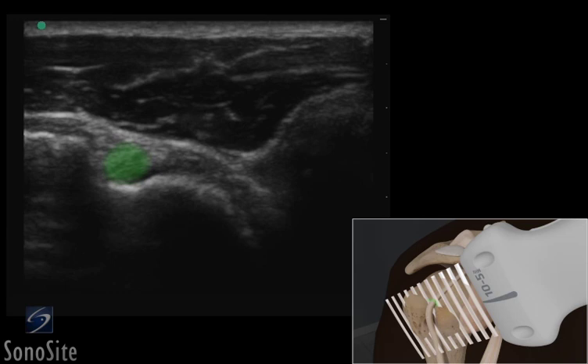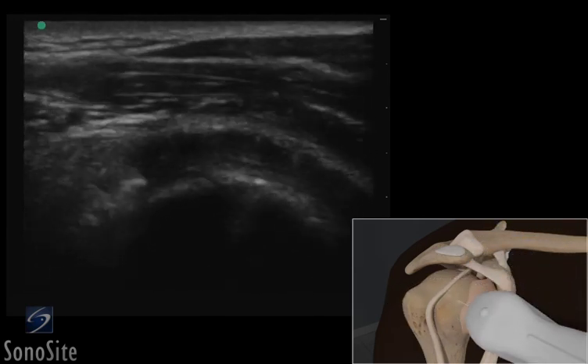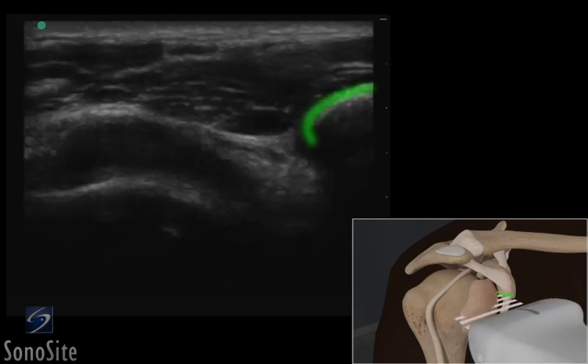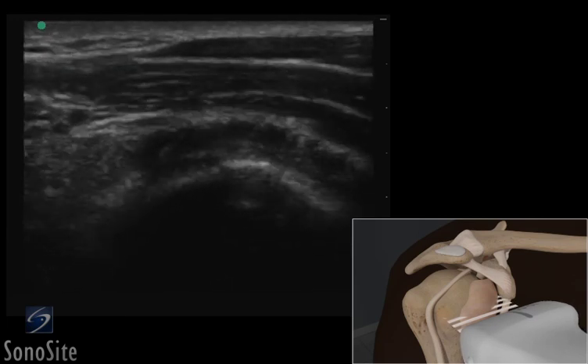The subscapularis lies below the deltoid muscle. The subscapularis tendon approaches the bright hyperechoic coracoid process with internal and external rotation and can be a cause of coraco-humeral impingement.